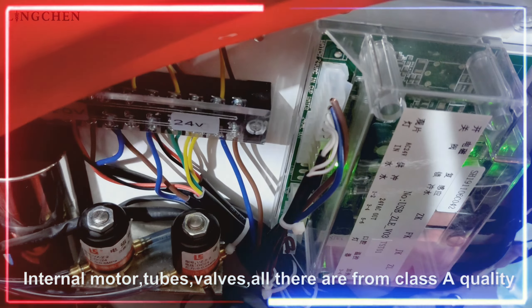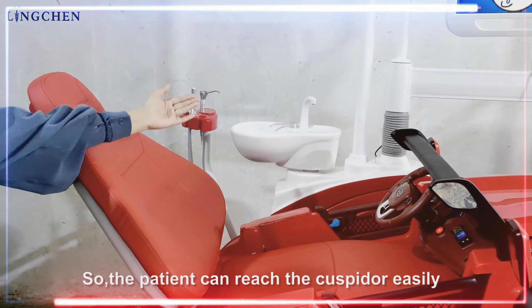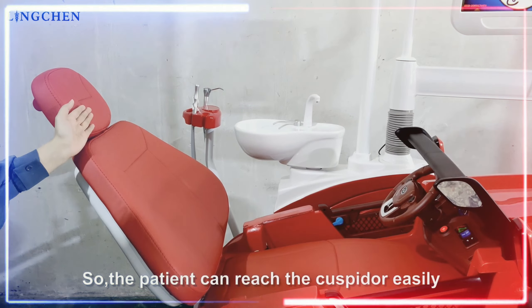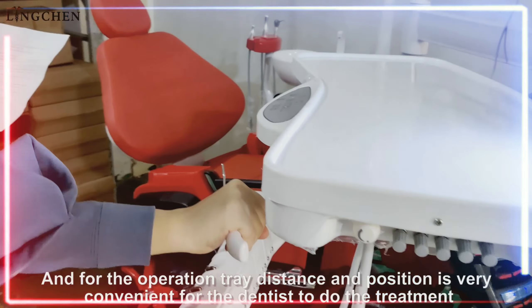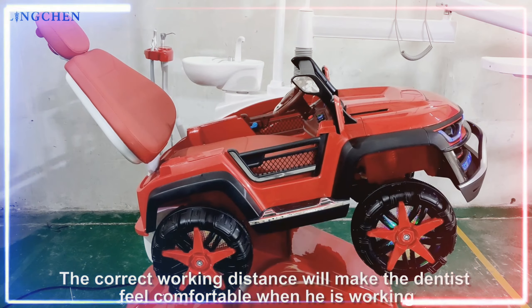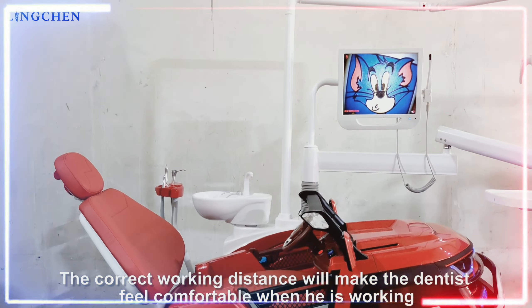In addition to these three points, there is one more point that is very important: the correct working distance. Just as a hospital should be easy for patients to reach, the distance and position of the operation chair is very convenient for the dentist to perform treatment. The correct working distance will make the dentist feel comfortable.